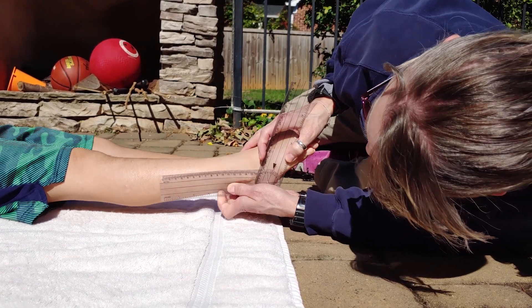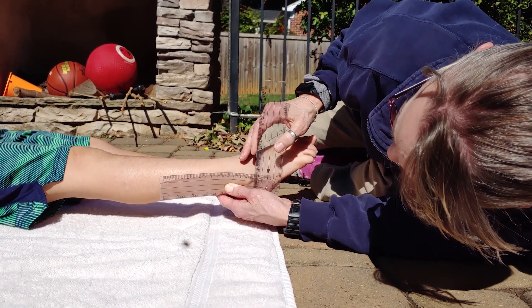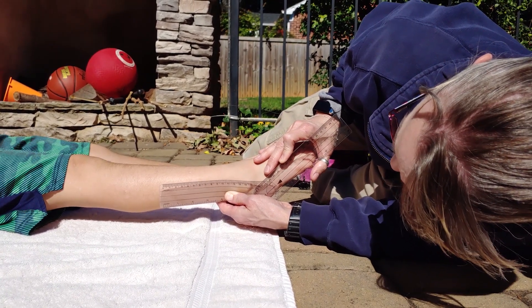He says he can go further. There you go. So there it is: 5, 10, 15, 20, 30, 35, 40, 45 degrees plantarflexion.